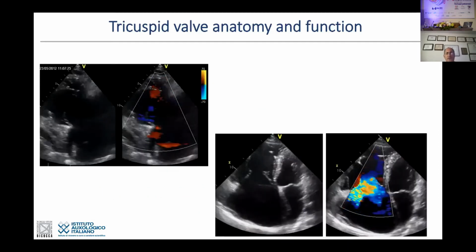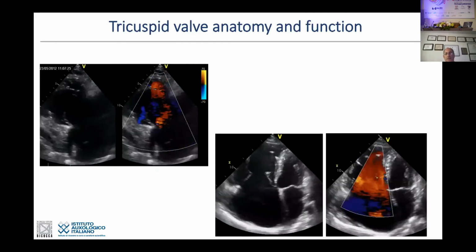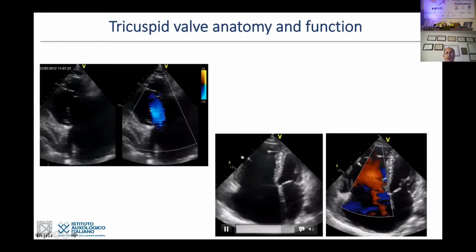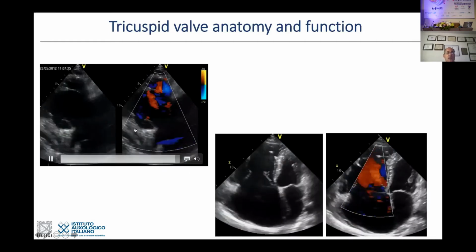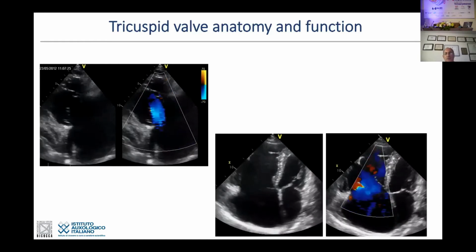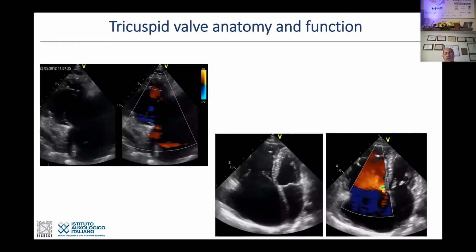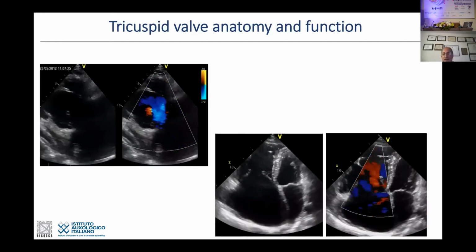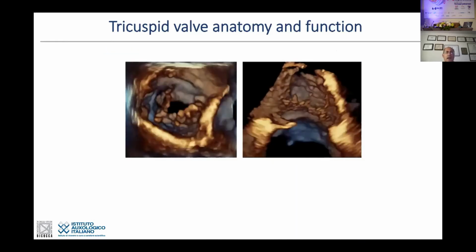The patient was sent for echo, and you see that he has a torrential tricuspid regurgitation with a large gap within the leaflet, and a quite enlarged right ventricle and right atrium. All these are the right ventricular inflow view from the parasternal approach. We looked at the leaflet, but we were unable to see really any abnormality of the leaflets until we turned on our magic 3D button.